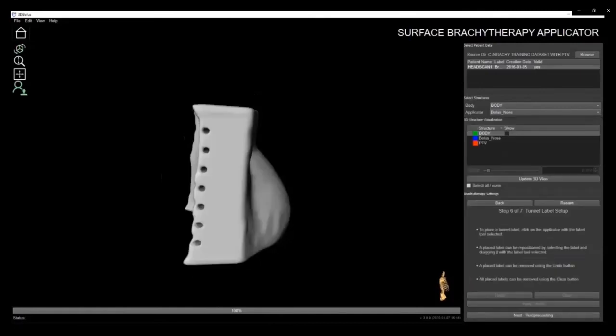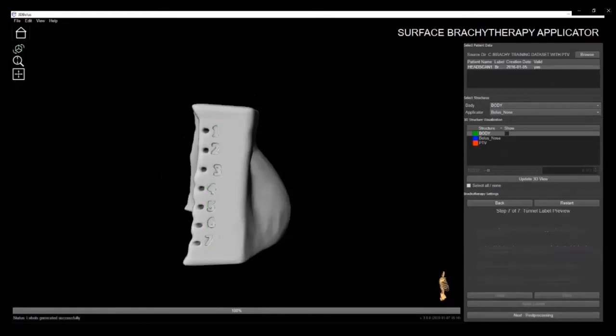The next step is tunnel labeling. Simply select the Patient Labeling button, which will turn green when activated. Then, click on the applicator where you want to place the tunnel numbers. You can move labels as required or delete them. When satisfied, click the Apply Labels button. Each of these labels will be printed directly in the applicator to aid in catheter placement.